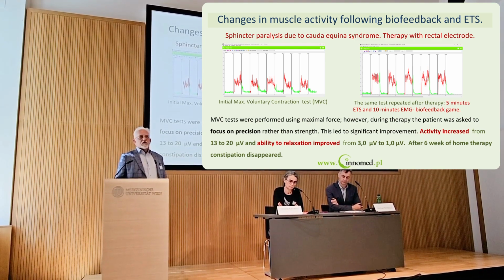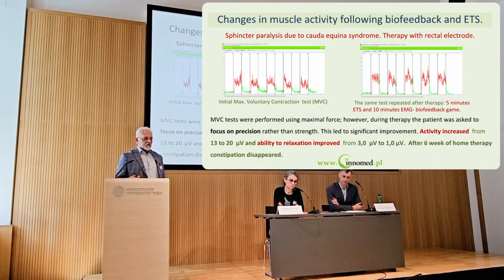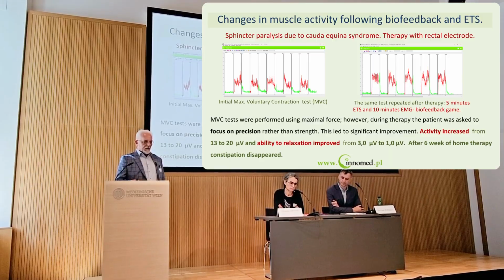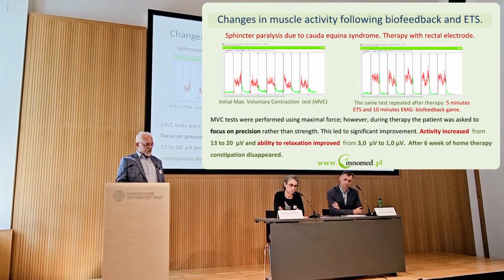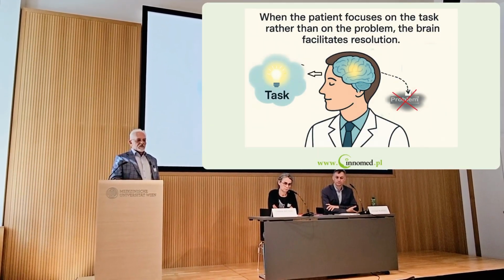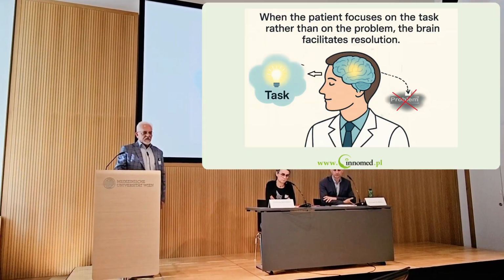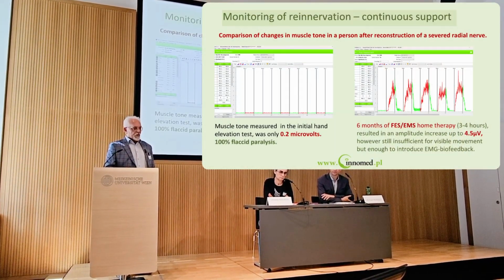It is very important to have good relaxation in sphincters while defecating. After 6 weeks of home therapy, constipation disappeared. So when the patient focuses on the task rather than on the problem, the brain facilitates resolution.